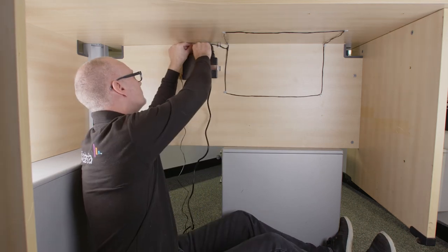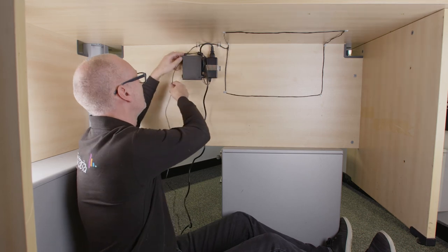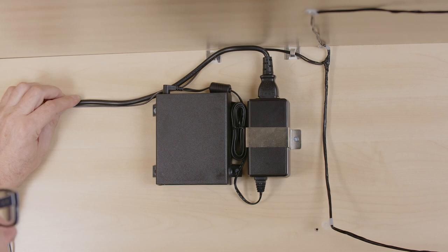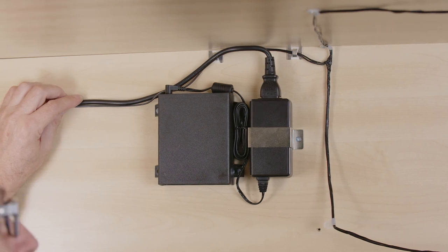Route all cabling securely, fixing cables into position using provided cable clips or other suitable fixings. Install the driver's power supply close to a power socket outlet using the supplied mounting bracket and fixing screws.